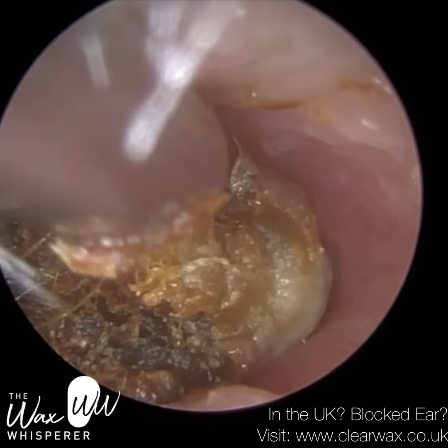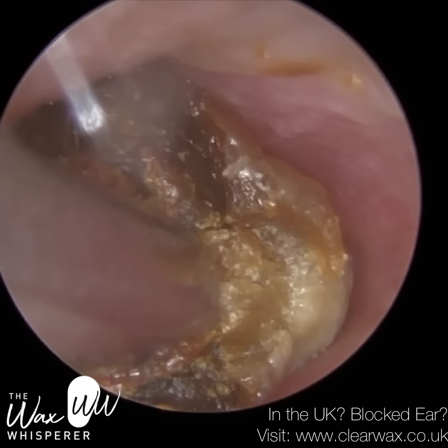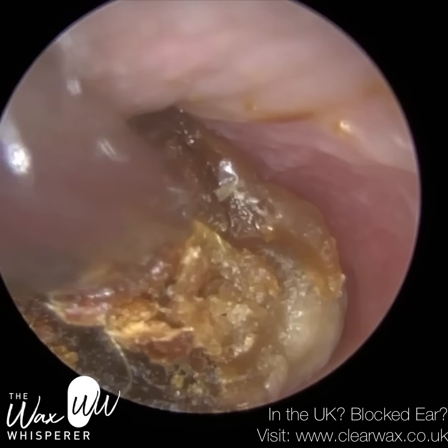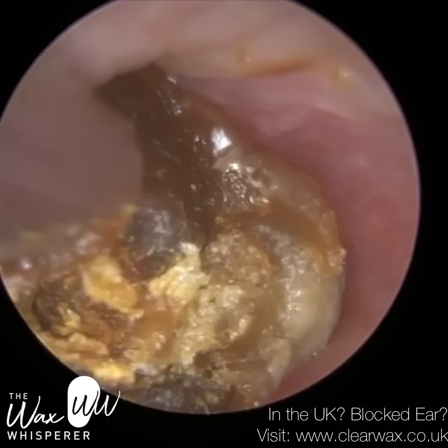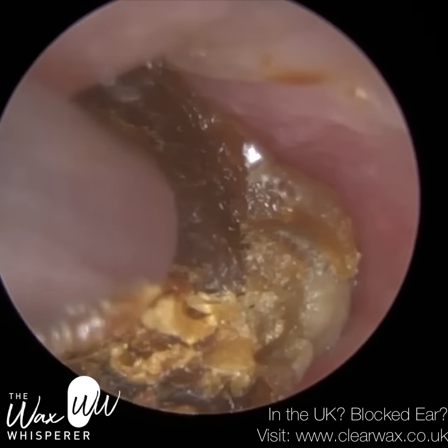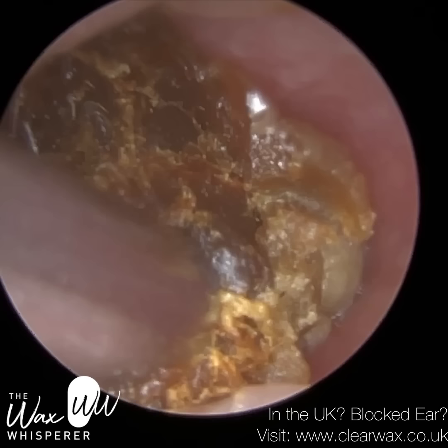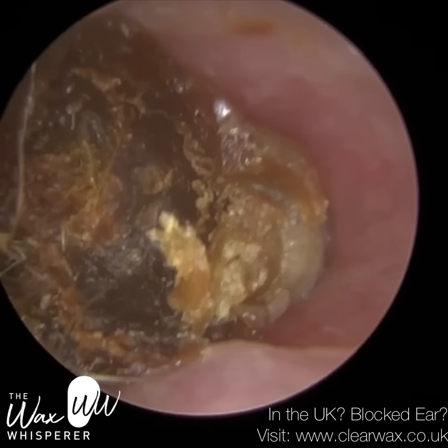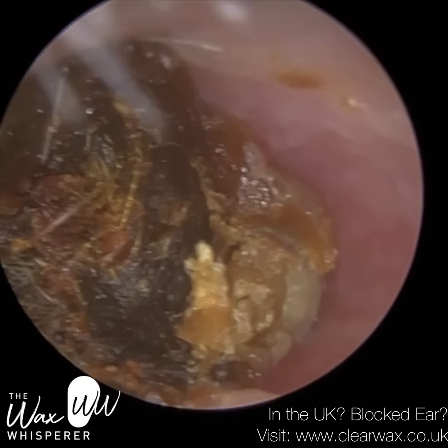So I would say this patient is a borderline 1 and 2, because they did report pain, but they wouldn't describe it as moderate pain. It was more mild pain. However, although it's not substantial, there is quite a widening. You can probably see it here at the top. That plug is out of sight. It goes up. The ear canal is also slightly swollen in front of it, so it's almost engulfing this plug of dead skin. So that's grade 2.